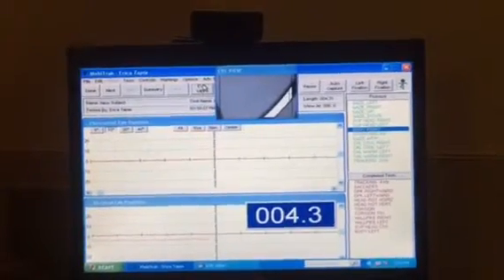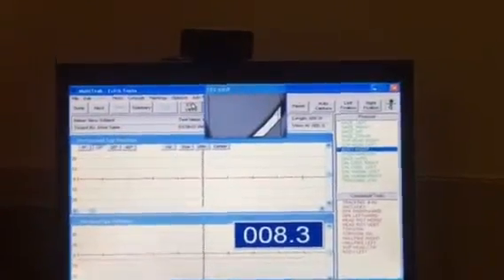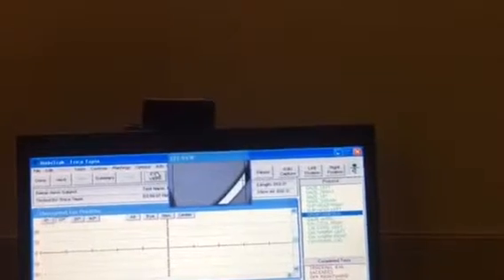This is where you remember the story in Florida where the doctor's patient fell off the table, split his chin open. Okay? So you don't want that to happen. Then they sit up because you're going to put the foam surface under them. The foam. The 45-degree angle. Okay?